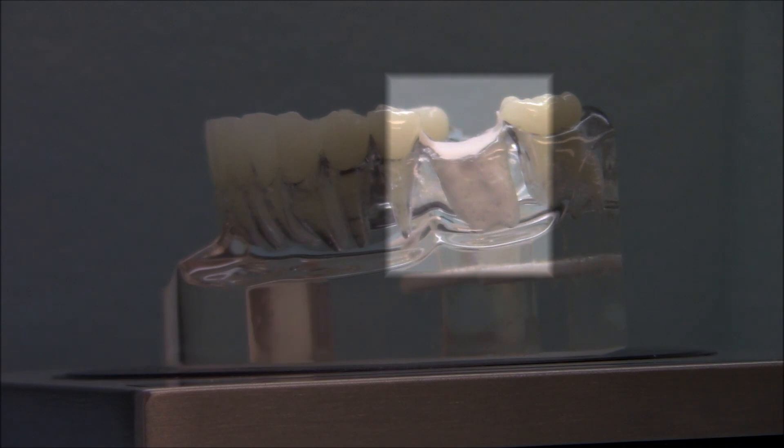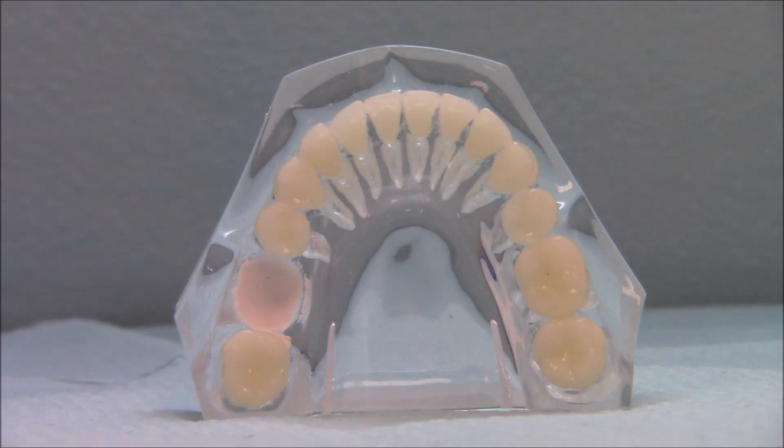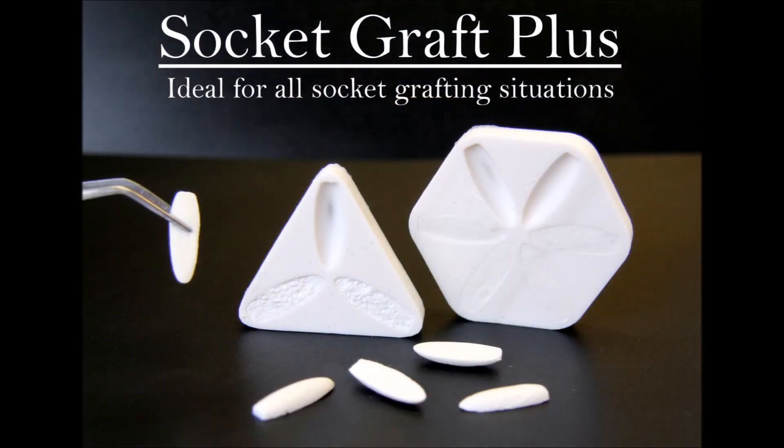Socket graft putty is intended to be used when all four bony walls are intact after extraction. However, when there are missing walls, we recommend using SocketGraft Plus, which is provided in the same delivery system as SocketGraft Putty. SocketGraft Plus contains our third generation beta-tricalcium phosphate granules, which helps maintain socket structure, but can also be used for all socket grafting situations.